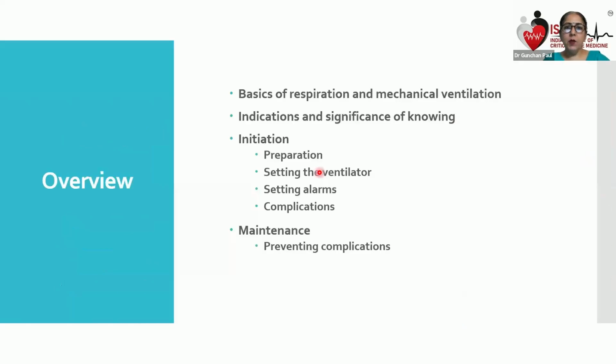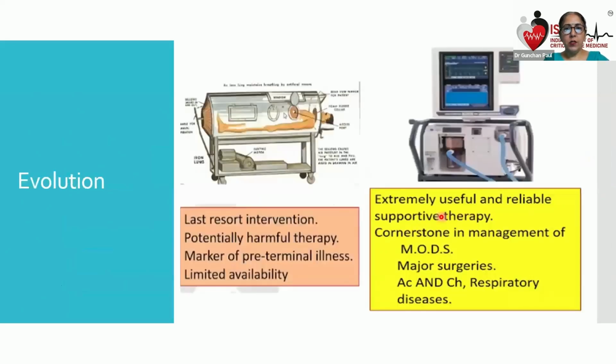So I'll be discussing the basics. What are the indications? What are the initial settings of the basic modes? And what are the alarms we should know to prevent any complications?